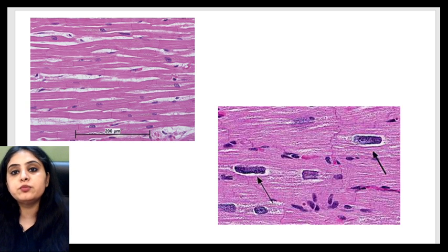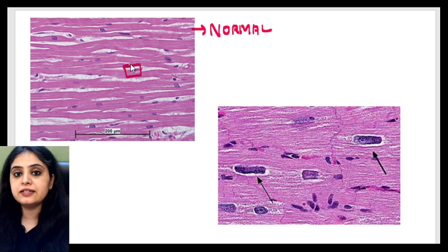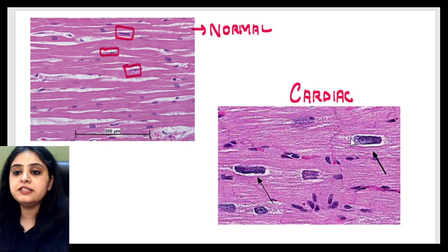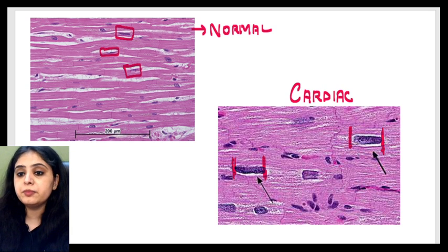Image number two for the day is this. Now what are these? These are normal cardiac fibers with normal nuclei — beautiful, slender nuclei. However, when you compare them with the cardiac fibers in this particular image, you can see there are broader fibers and the nuclei are looking like a box car — they have a classical box car appearance.